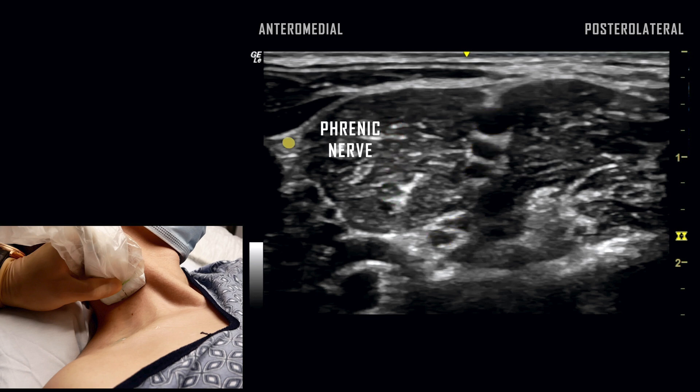The phrenic nerve is located anteriorly to the anterior scalene muscle. The vertebral artery can also be identified. The neck is highly vascular and colored Doppler imaging is often helpful to avoid vessels.